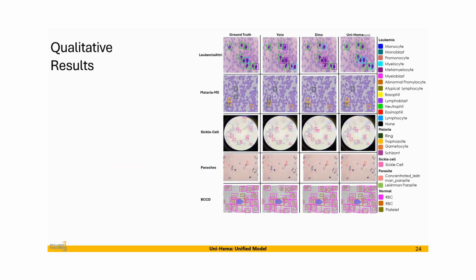These are the qualitative results of the detection. The dotted white boxes denote the misdetections, while the dotted color boxes represent the incorrect class predictions. Across the diverse datasets, our single unified model achieves strong localization and class consistency, performing on par with the specialized detectors in challenging cases.